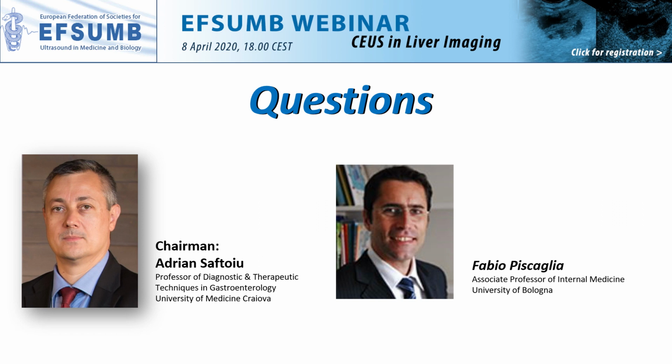In between, you can utilize CEUS to detect local recurrence, but CEUS alone is not enough for the follow-up of treated lesions. Okay, thank you very much.